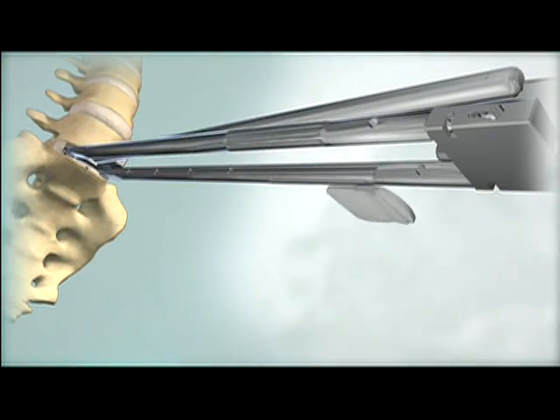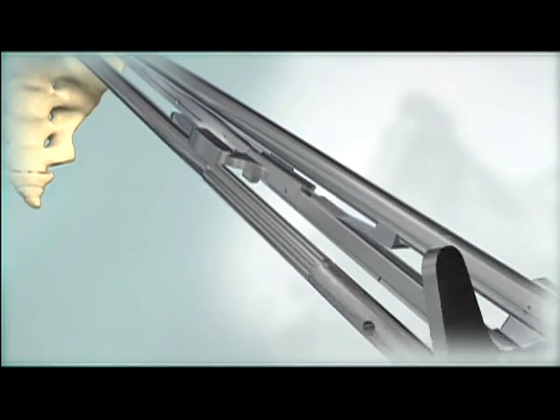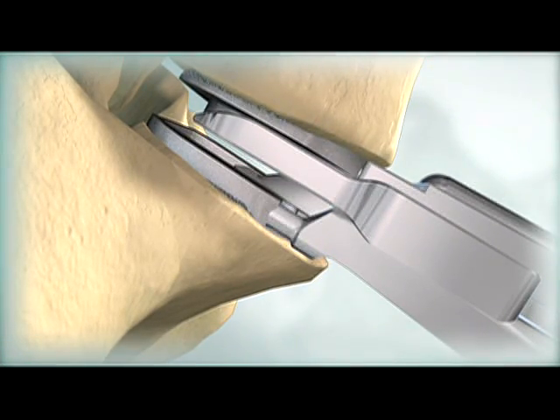Load the polyethylene inlay into the grooves in the inferior arms of the inserter. Assemble the distractor to the inserter. Use the thumbscrew to fully advance the distractor. Verify that the posterior edges of the end plates have separated from each other.